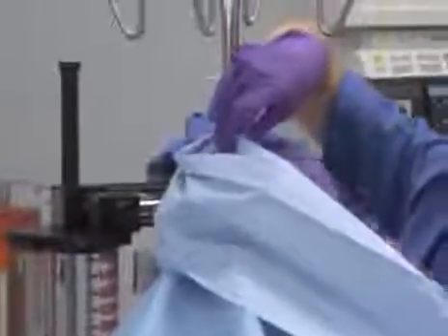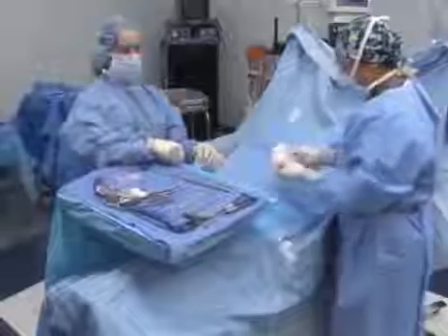Keep your hands on the sterile side of the drape or towel. Use only non-penetrating towel clamps for securing drapes. A hole in a drape allows a passageway for bacteria to contaminate the sterile field. When drapes are stapled to the patient's skin, the stapled area should be covered by an impervious plastic drape.